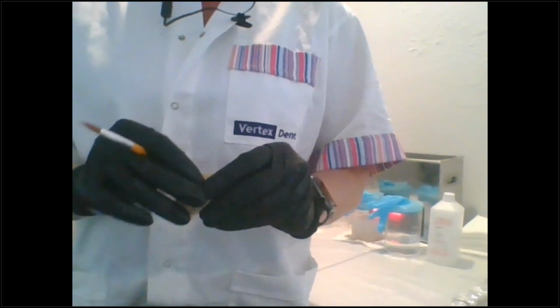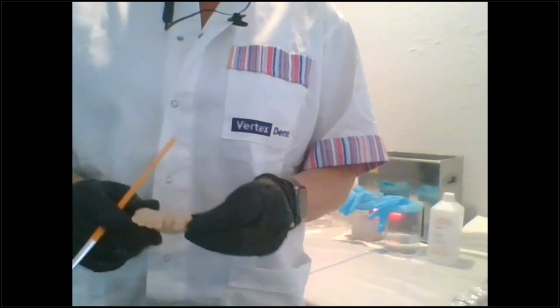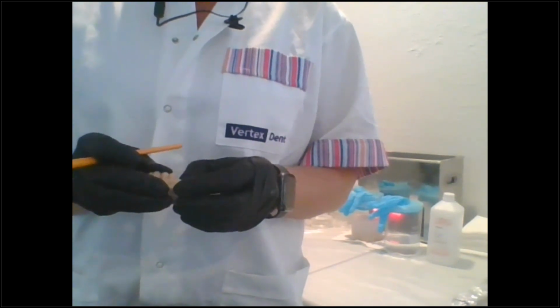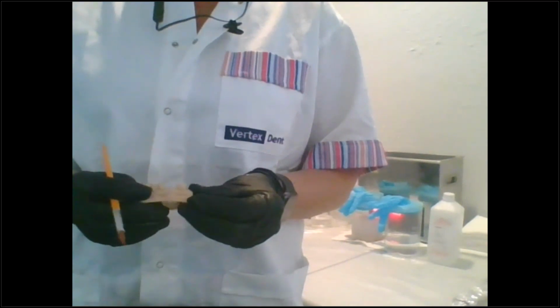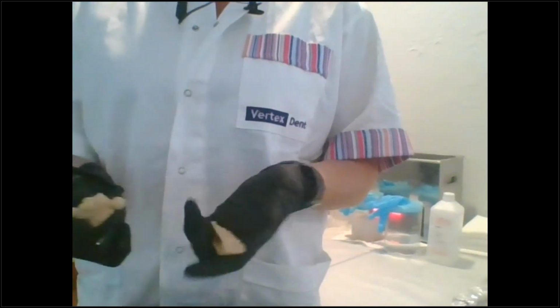And they both equally have a nice fit of die. So if you use the ExoCAD settings, if not, I can give you some parameters to use. Really what it is, that horizontal shaft gap, the gap between the die and the model, needs to be 20 microns, 0.02, excuse me, 20 microns. So then it's ready to articulate.